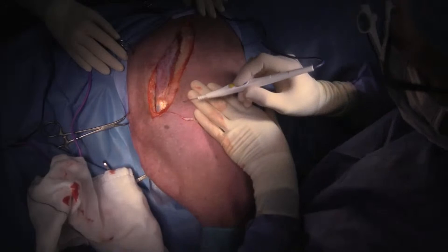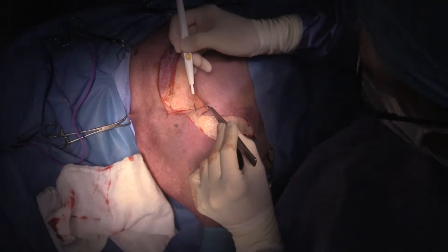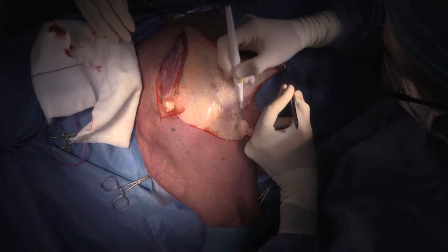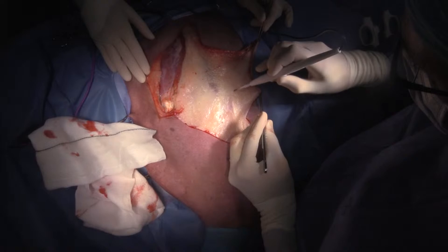This dog is eight years of age, which is the median age of dogs with osteosarcoma. I'm just going to reflect this skin caudally. We're going to come around the back and transect the latissimus dorsi muscle — that's the main one back here.